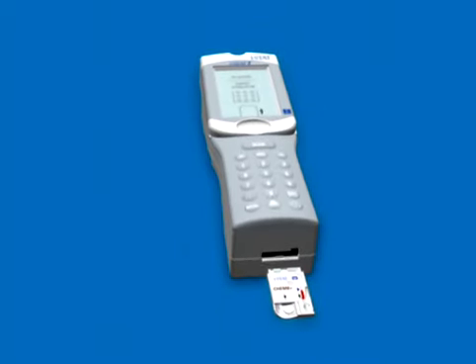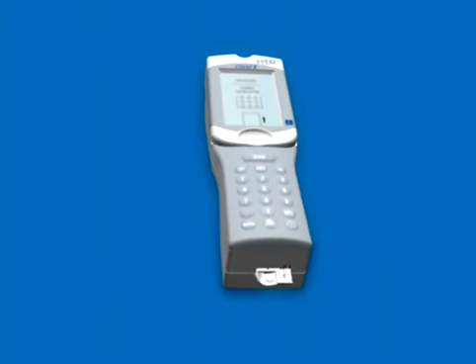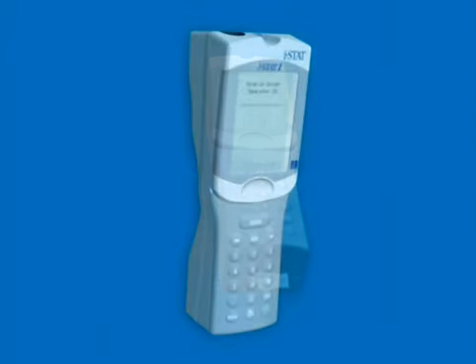Insert the cartridge containing the blood sample into the analyzer's cartridge port. Please note, do not try to remove the cartridge during the testing cycle while the cartridge locked message is displayed. Doing so will seriously damage the interior of the analyzer.